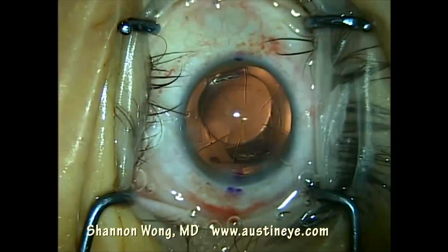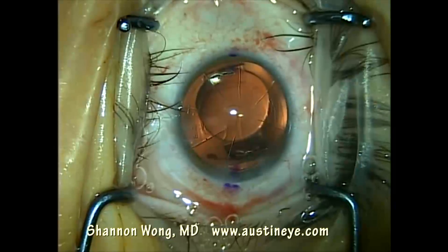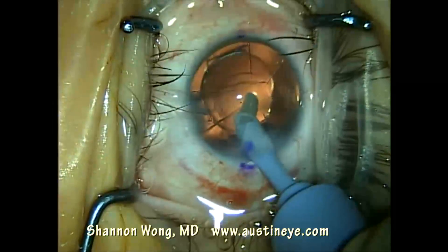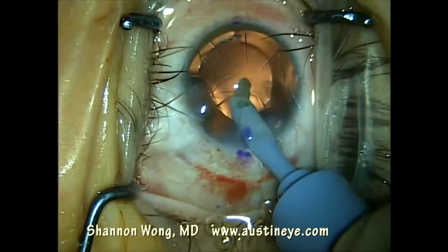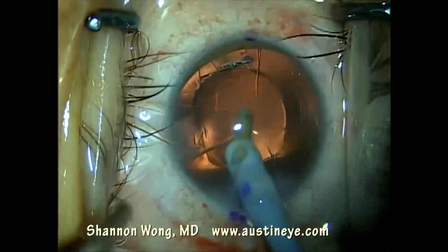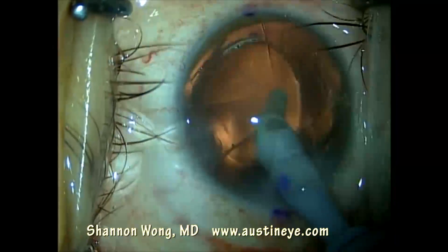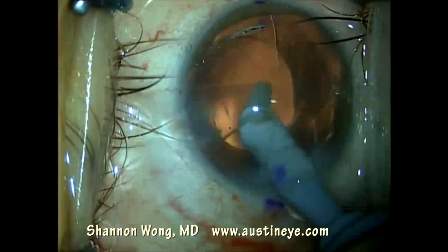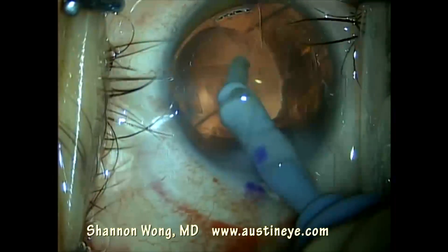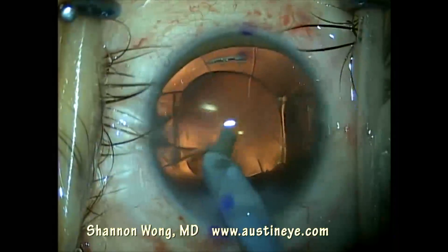Usually I'm able to get three, if not four, haptics in the bag. Here I've got three haptics in the bag, and I'll just use my silicone tip IA to rotate this lens slightly counterclockwise — in that movement the fourth haptic will drop down into the capsular equator. We then assess at what orientation the lens would best fit within the capsulotomy opening we have created.